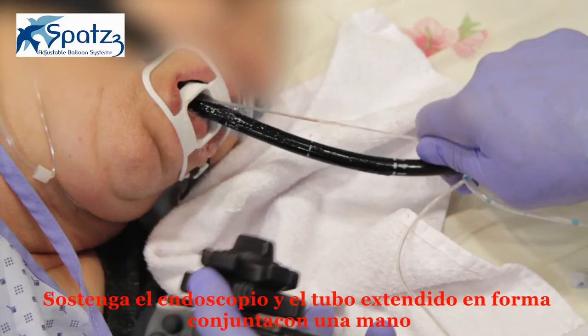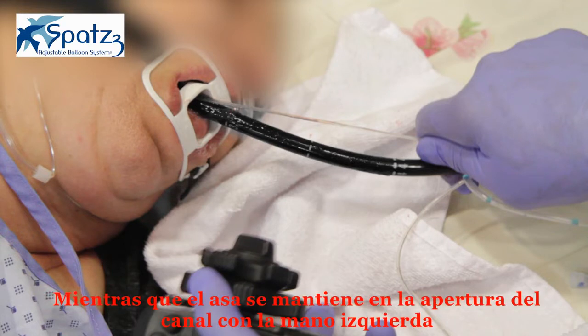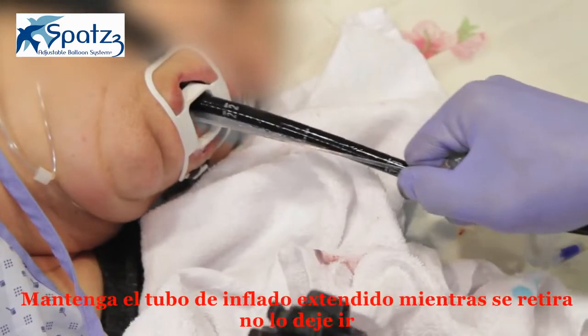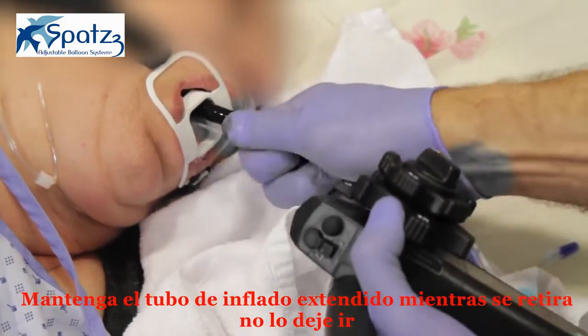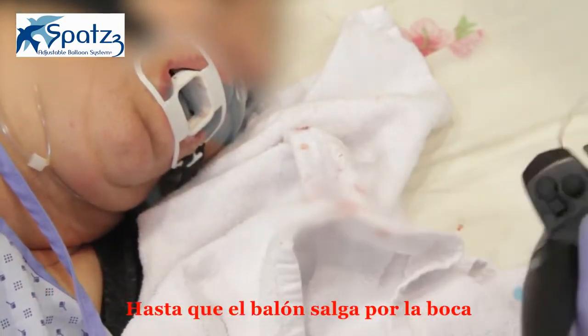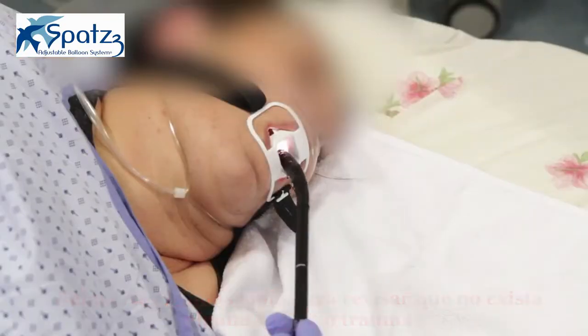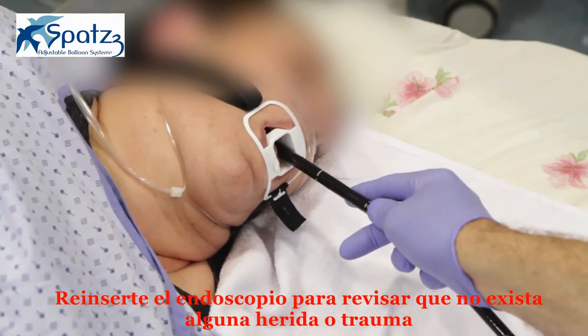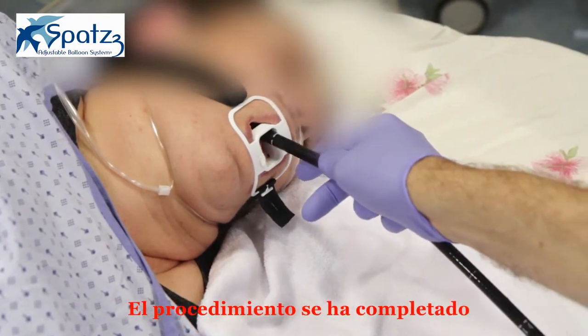Hold the scope and stretched inflation tube together in one hand, while the snare is maintained at the channel opening with the left hand, and pull out together. Keep the inflation tube stretched while withdrawing. Do not let it go until the balloon exits the mouth. Reinsert the scope to inspect for any tissue trauma. The procedure is now complete.